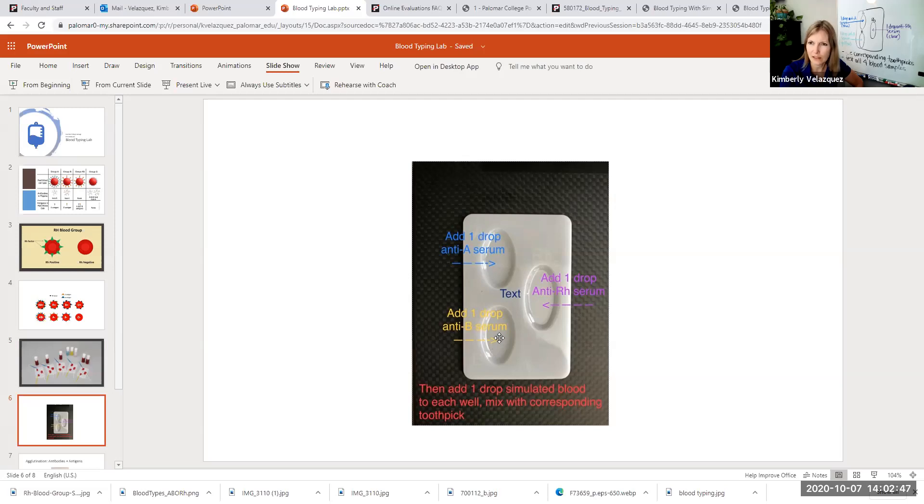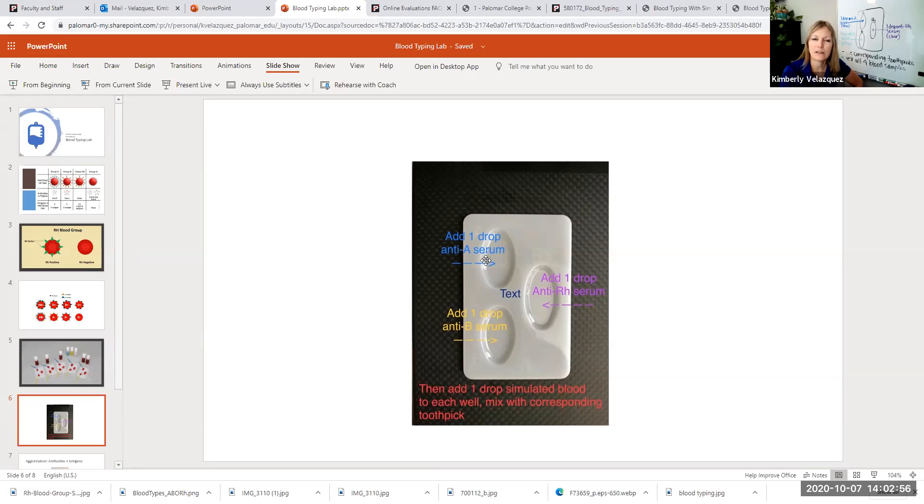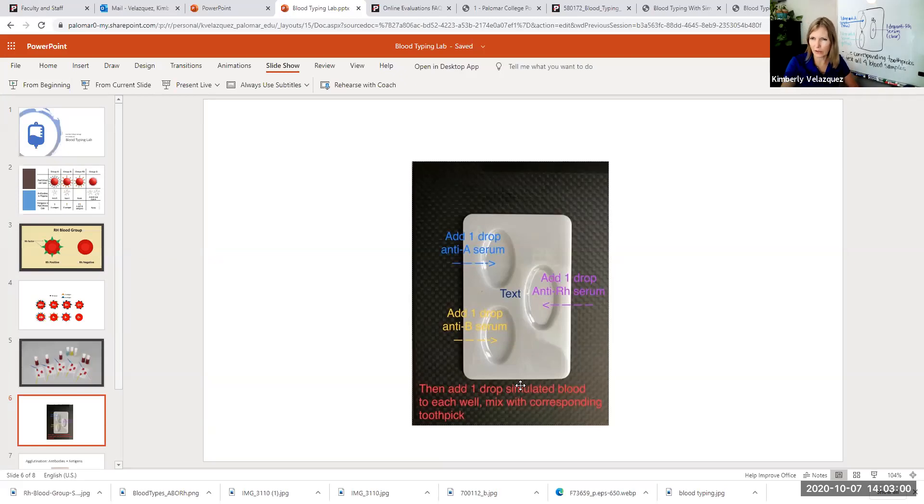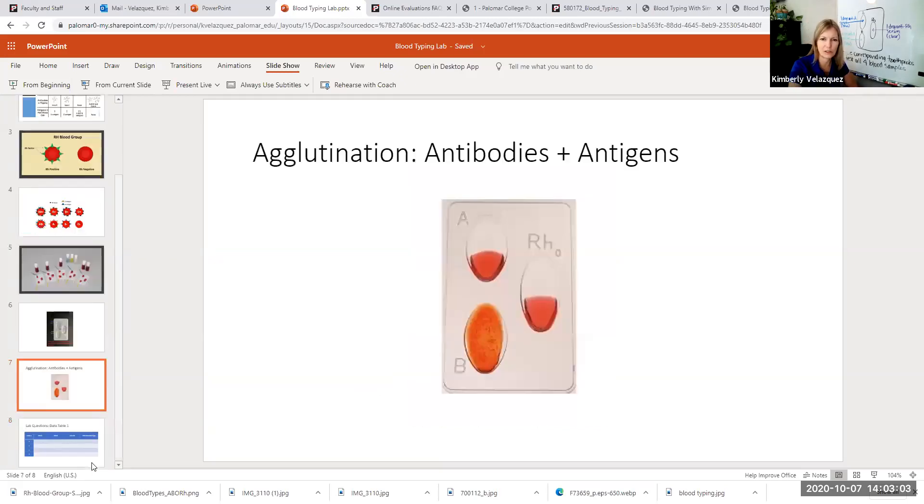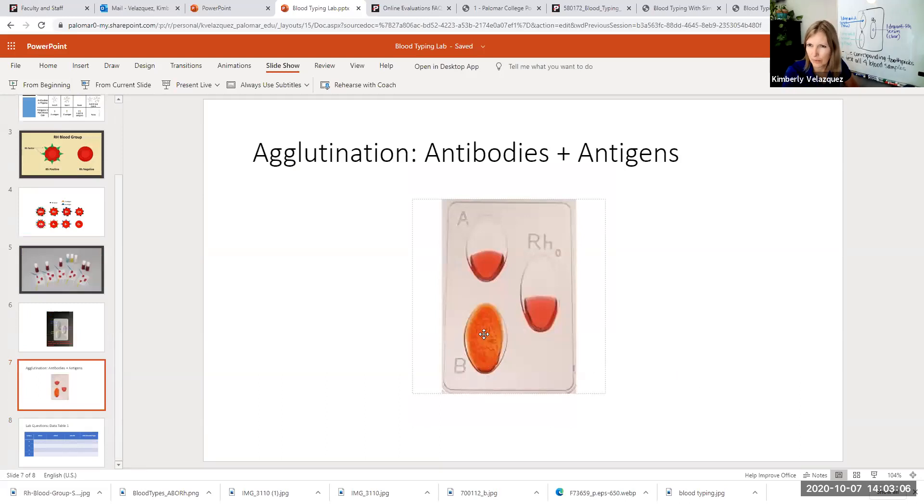Then one drop of the anti-B goes in this well. And then one drop of the anti-RH goes in this well. Then you add your blood sample and you mix with the appropriate color of toothpick. And you are looking for agglutination. What that will look like is it starts to clump.